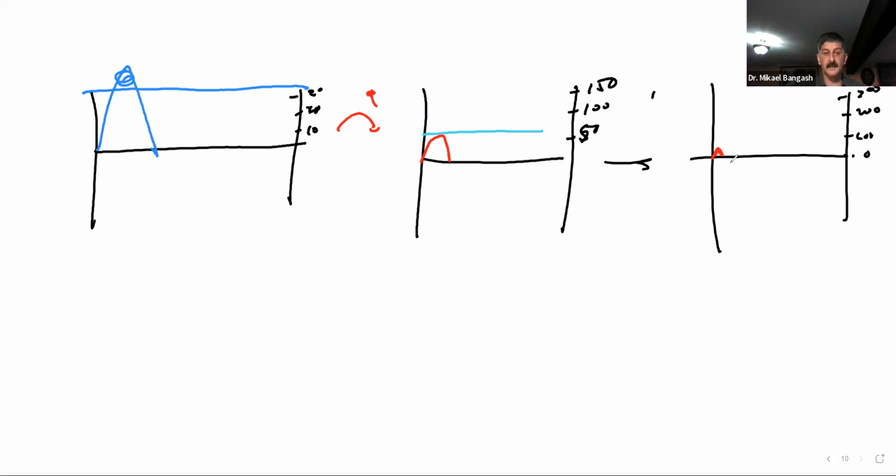Because your scale gets less and less sensitive to low velocities. We can say the velocity in the beginning here was low because we had set it at a max of 30. But when we increase the scale, that graph that used to be big became smaller.